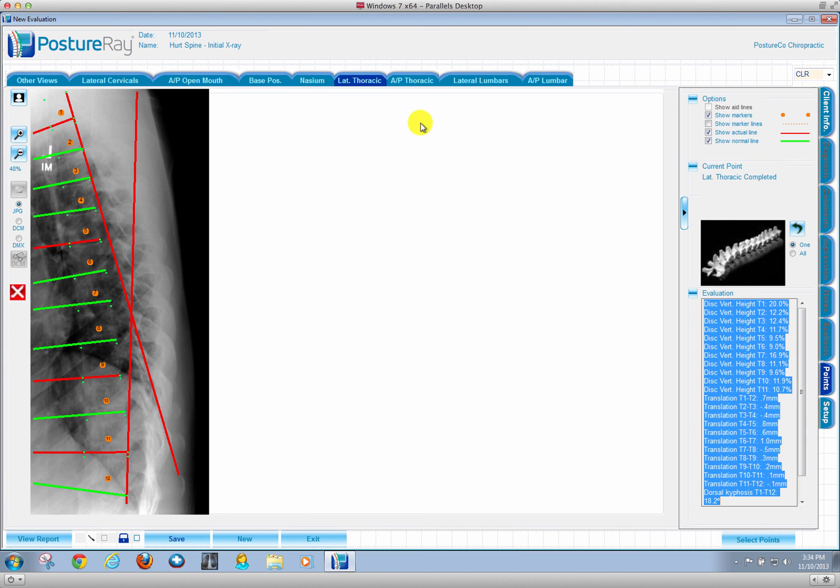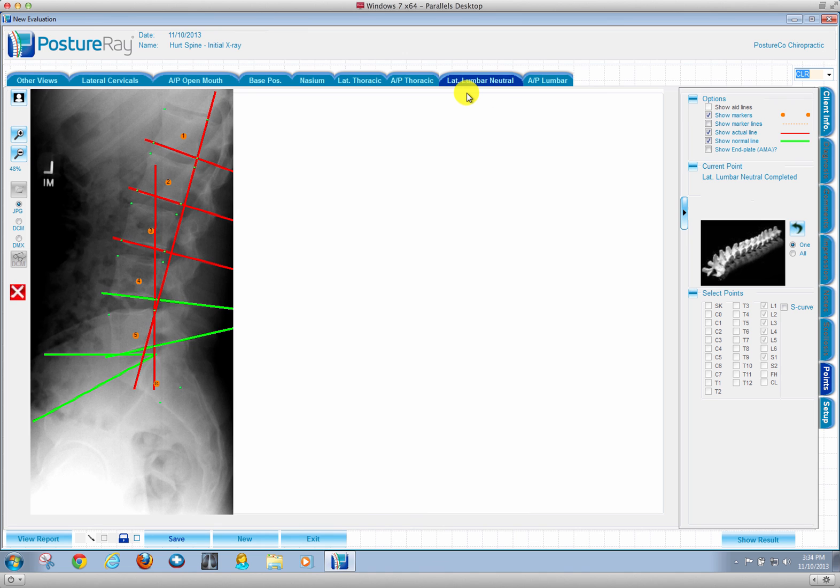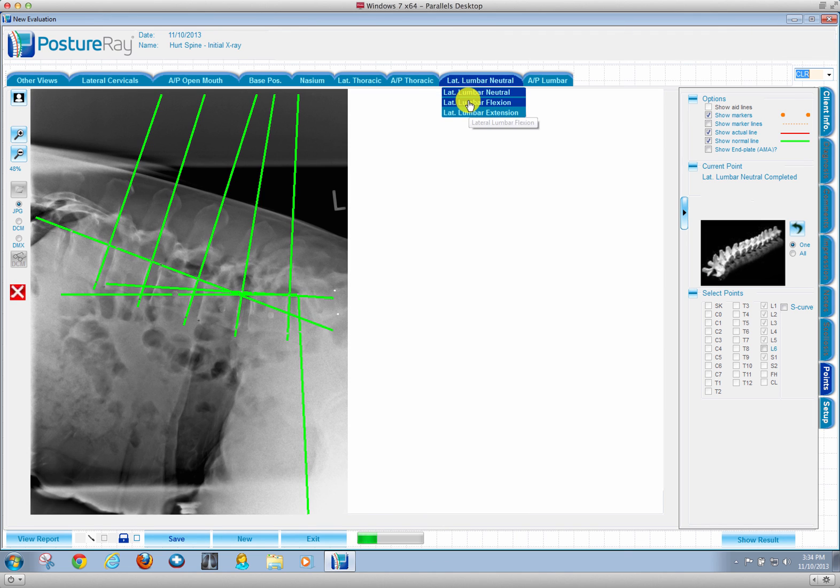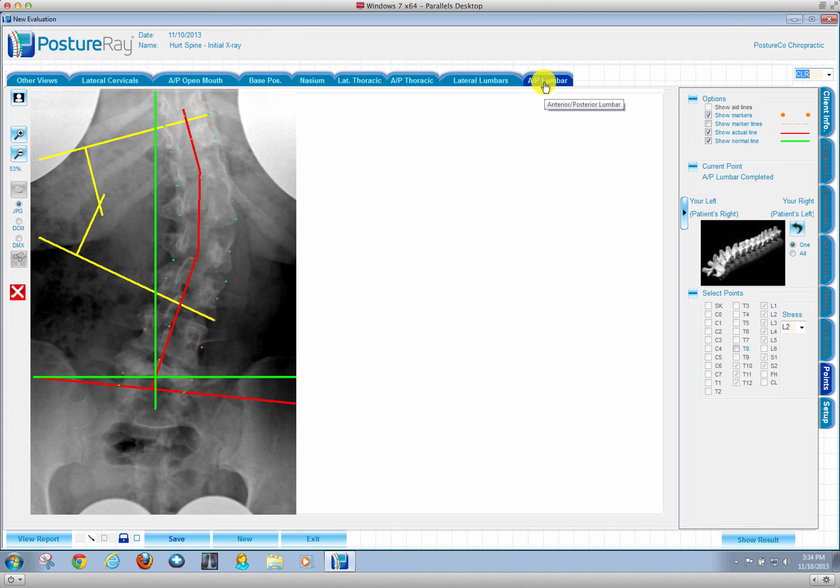We can do scoliosis, lumbar, even with flexion extension, as well as scoliosis on the AP lumbar as well.